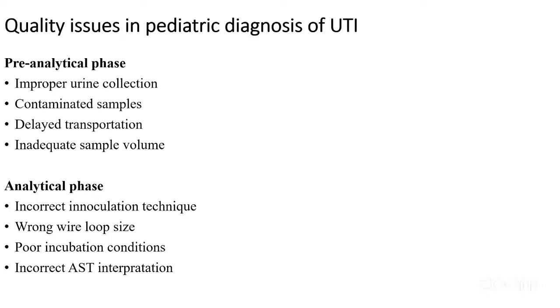Generally the lab is the one that guides the doctor on which route to take: either to stop, to give a stronger antibiotic, or to conclude that there was no urinary tract infection, or that the organism isolated was normal flora. So we have to have some quality measures put in place, and that's why I documented this.